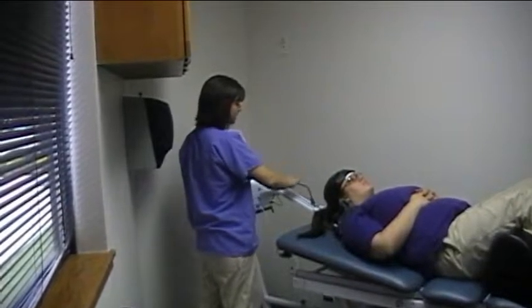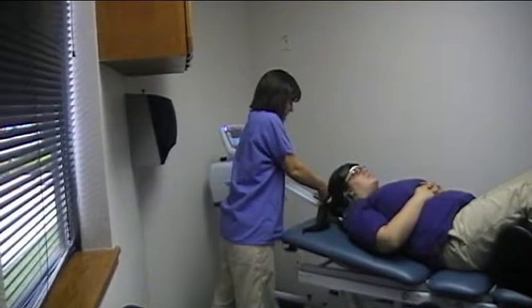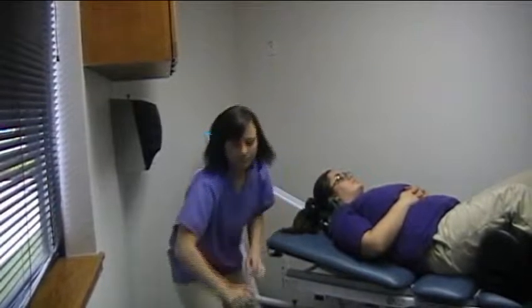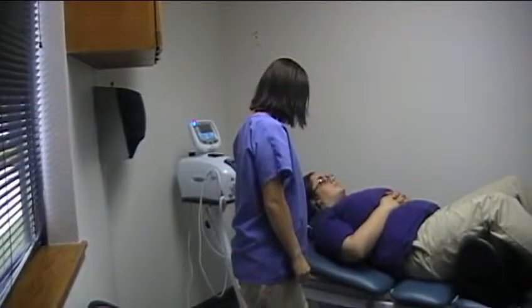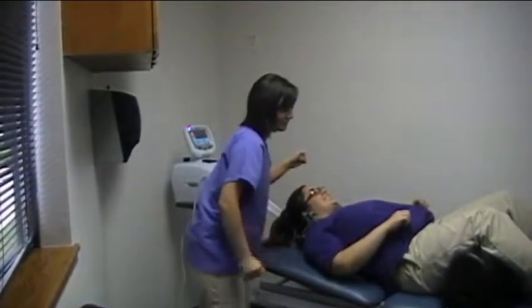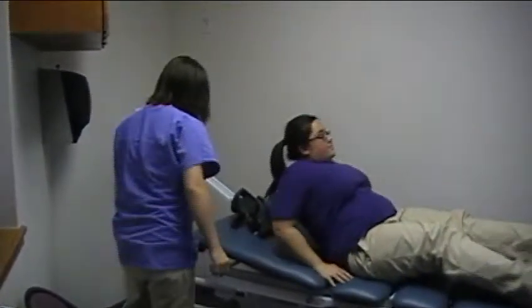When taking the patient off, the first thing you want to do is release the rope and remove the head harness. Then release the bolsters around the neck and remove the ones from under the knees. Have the patient sit over on the edge of the table and just sit for a minute, then help them off.